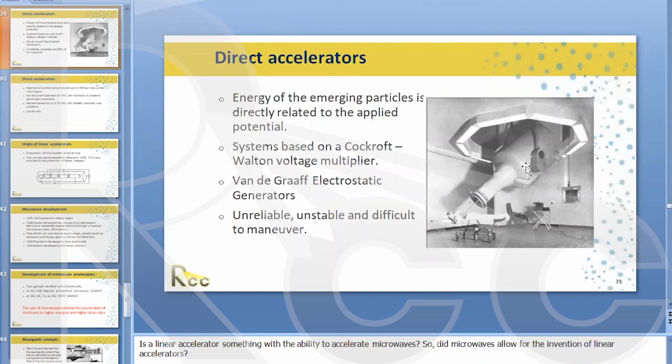Second, in a busy clinic, you can't treat as many patients because it takes longer to treat the patient. So I like to say, dose is dose. You could give 70 gray with the linear accelerator, you could give 70 gray with the Cobalt machine. It's going to be the same dose. It's going to do the same damage. It's going to do the same harm. But how you deliver that dose is so important.